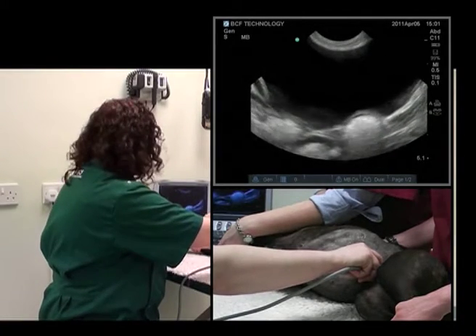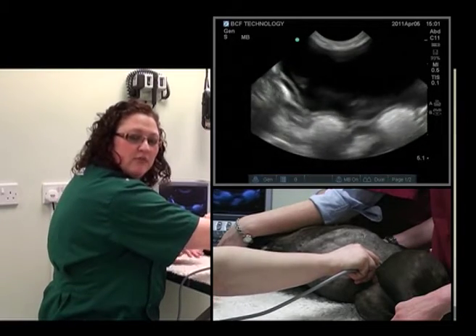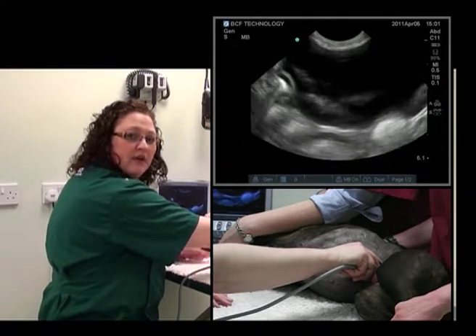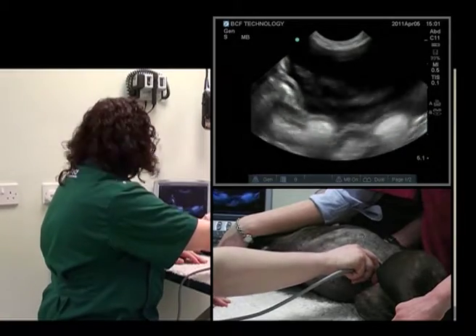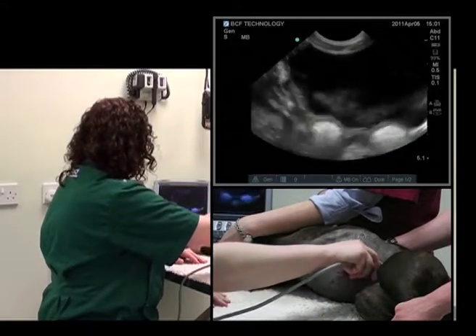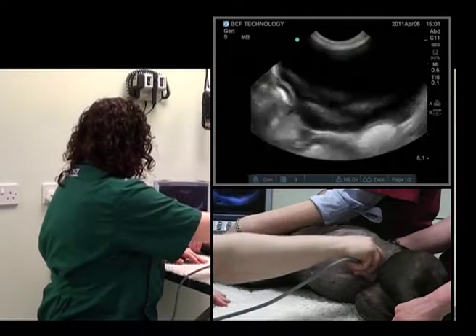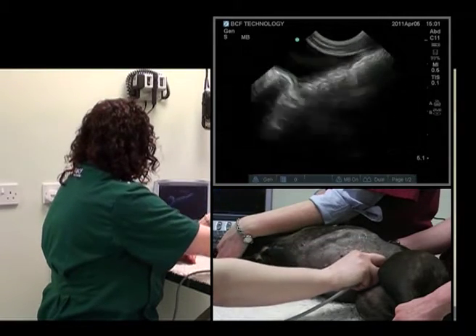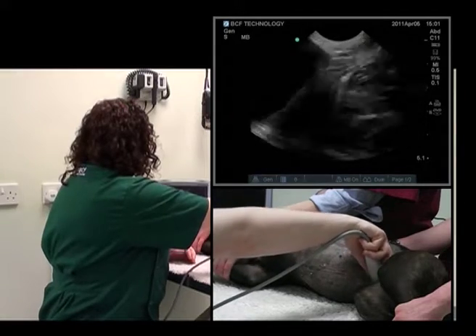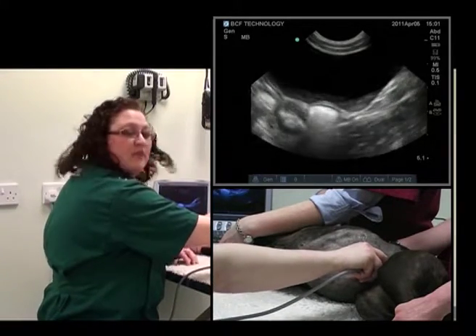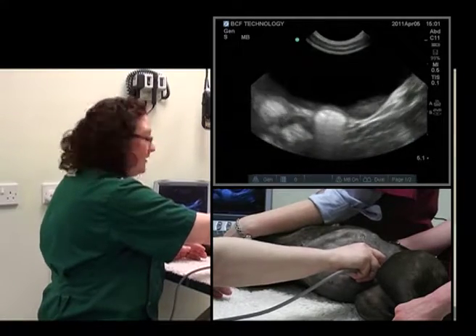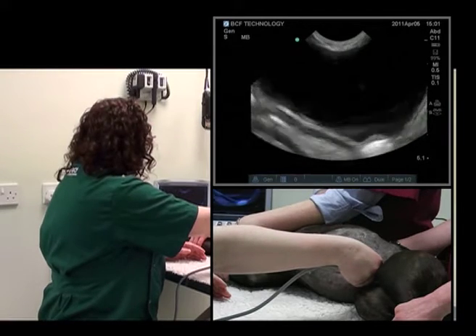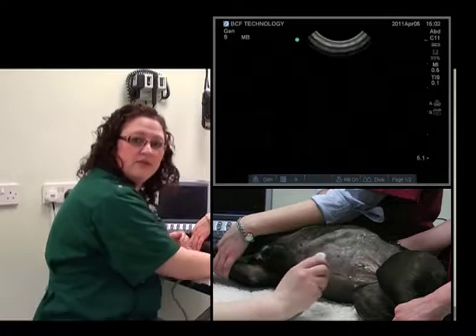That's better. We'll start at the cranial margin of the urinary bladder and we can fan up and down in order to evaluate it. We can then move caudally and repeat. We can then rotate through 90 degrees clockwise and slide cranially, and we've seen the entirety of the urinary bladder.